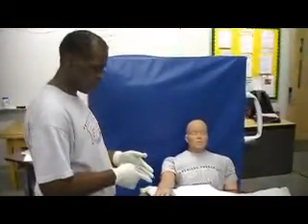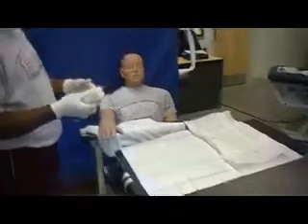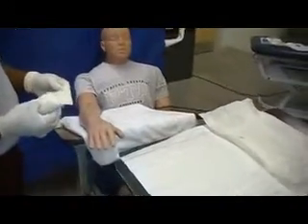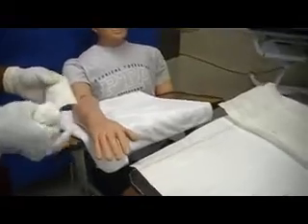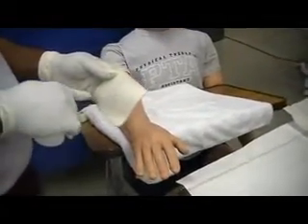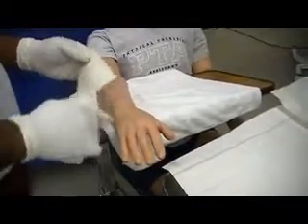Right, now what we want to do is properly place the 4x4 and the gauze on the patient. But the major concern is making sure that we cover all the borders of the 4x4s so that there are no contaminants that can seep into the wound area.